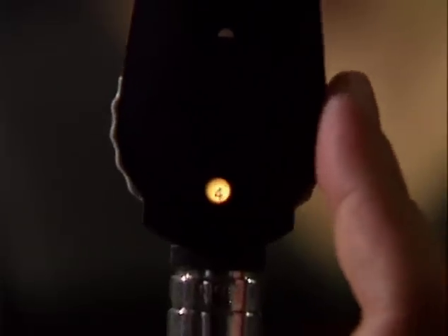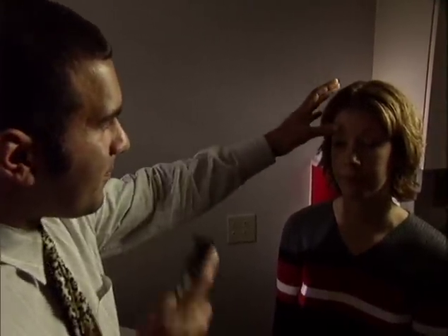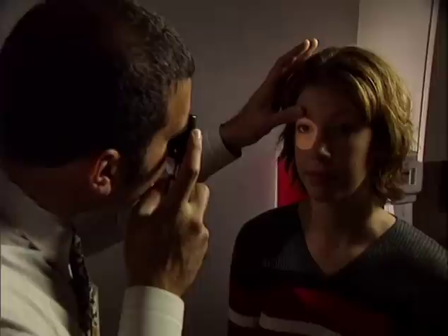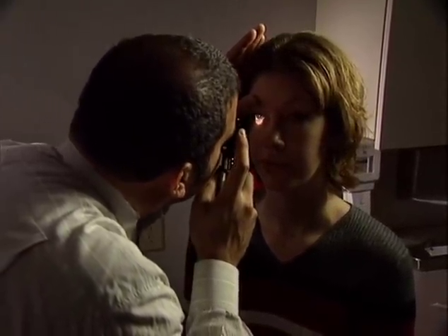A simple way to remember this is in financial terms. If you're in debt, you're in the red. Have the patient fixate on a distant target. Position yourself at a 15-degree angle at the side of the patient. Place the thumb of your hand opposite from the ophthalmoscope on the patient's eyebrow to prevent you from bumping into the patient. Look through the ophthalmoscope.